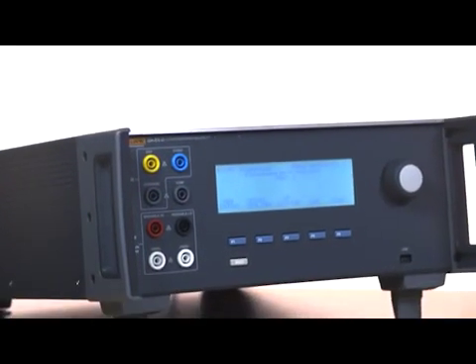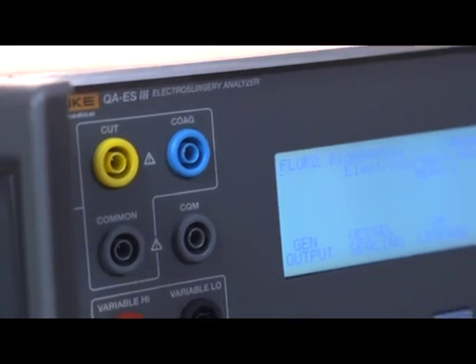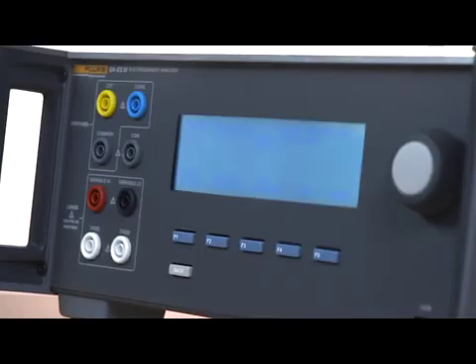Meet the Next Generation Electrosurgical Analyzer, the Fluke Biomedical QAES-3. This all-in-one analyzer offers improved functionality, accuracy, and ease of use over its predecessor, the QAES-2.